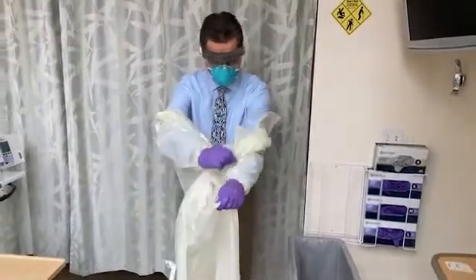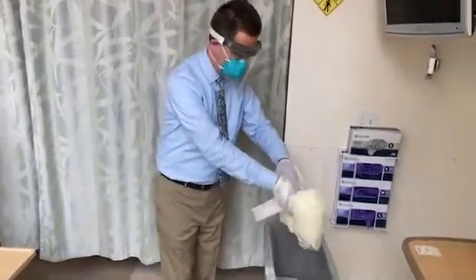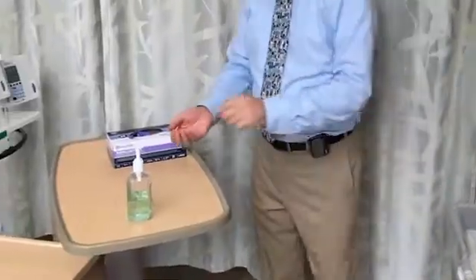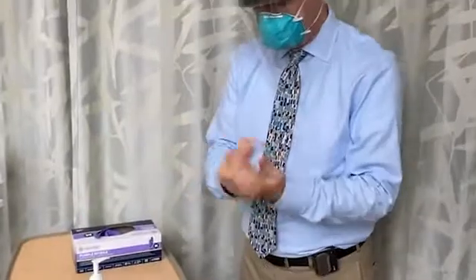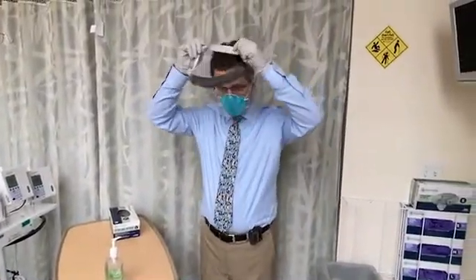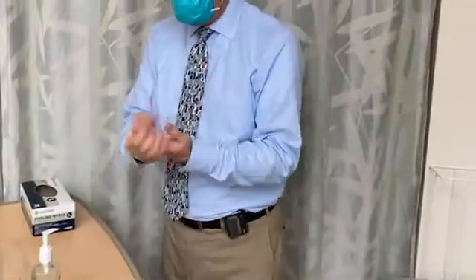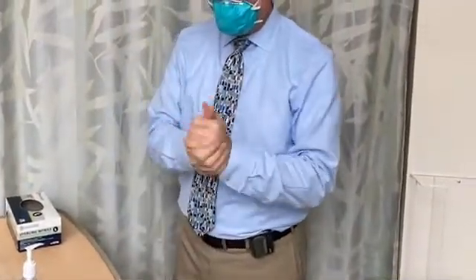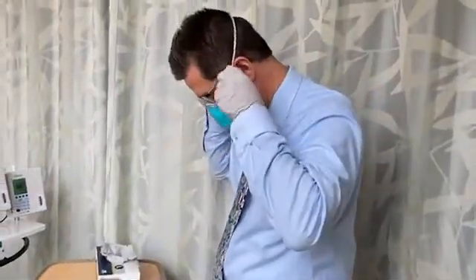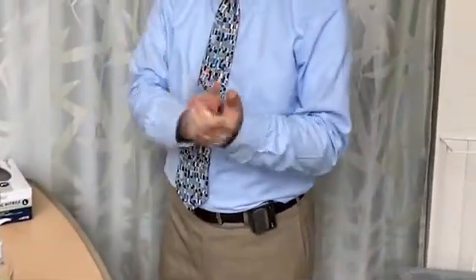Remove your personal protective equipment, as shown here, or in accordance with the standards at your institution. Clean your hands with an alcohol-based solution or soap and water. Put on a new pair of gloves and then remove your face shield and dispose of it, or clean and store it, in accordance with the guidelines at your institution. Remove your gloves. Re-wash your hands and put on another pair of gloves. Then remove your mask and follow your institutional guidelines for disposal or reuse. Finally, remove the last pair of gloves and wash your hands.